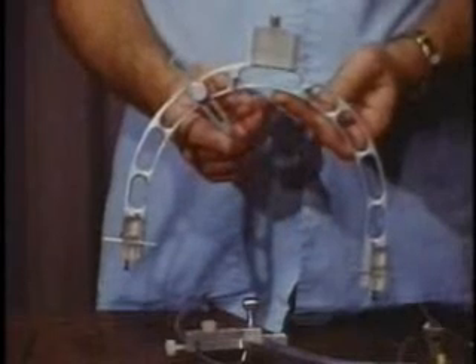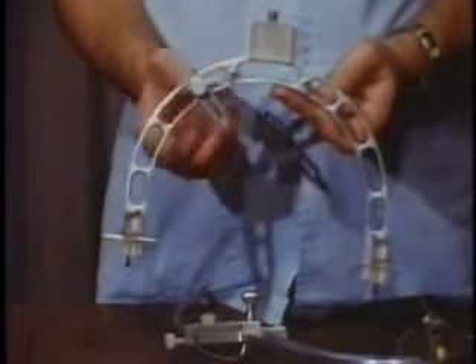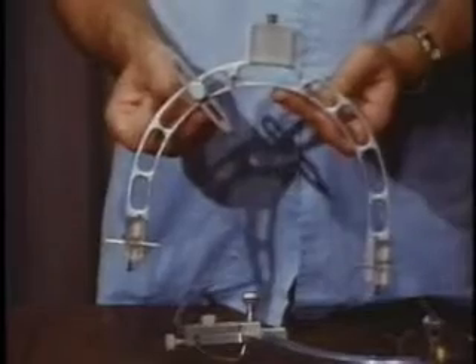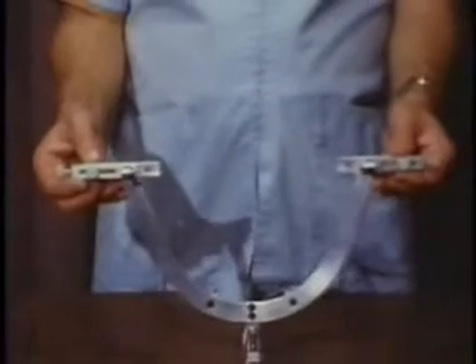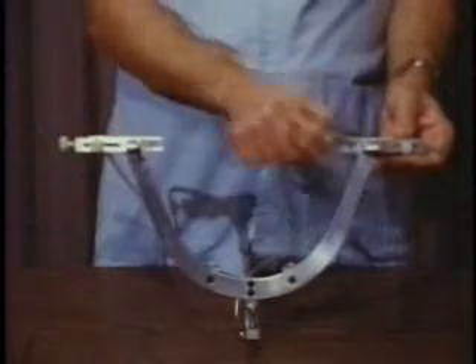A pointer located on the right side of the bow orients the recordings to the orbital axis plane of reference. The lower face bow is also a rigid, lightweight metal structure. It supports three recording drills which are driven by high-speed air turbines.